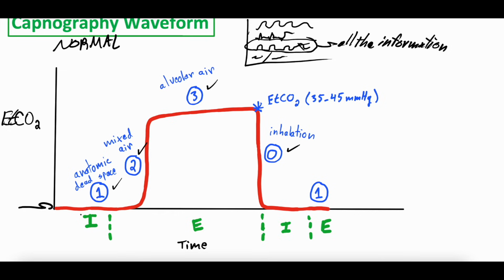We'll get into inhalation again, but let's start with the end of inhalation. So this here is where I started to inhale, and then I'm inhaling, and right when I'm done inhaling and I start to expire, that is expiration, that is this point. And that starts with phase 1. And phase 1 actually first starts at 0, the same end-tidal that is during inhalation.